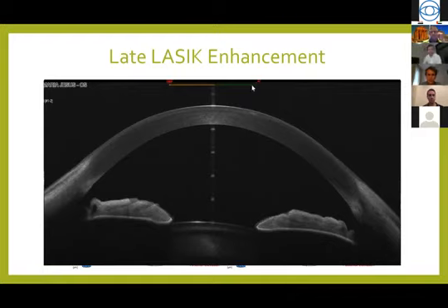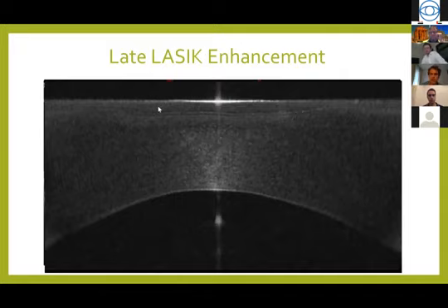But still here, you have to identify the thickness of the flap in order to determine if the enhancement you are going to do is safe or not regarding this residual stromal bed. It's not that easy to identify the thickness of the flap. But here, with the anamorphic image, you can precisely see, as Sadi already showed us, this black line that actually is the area of the surgical plane of the LASIK, of the flap, okay? And then you can precisely identify how thick it is and what amount of tissue you have underlying the flap.